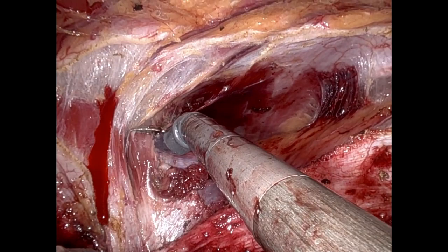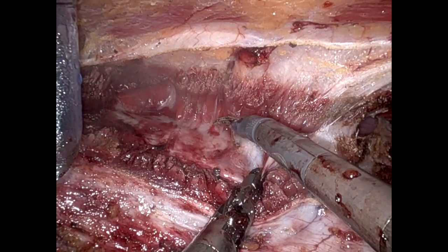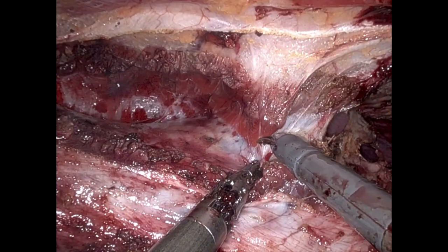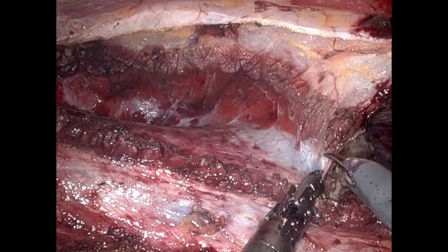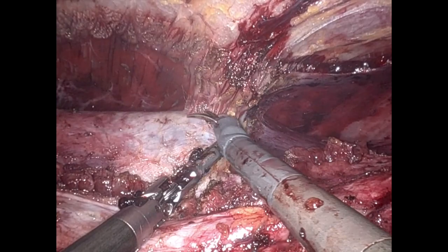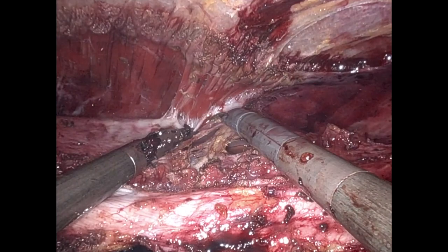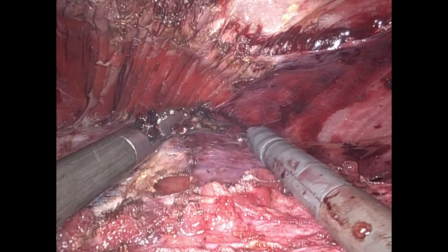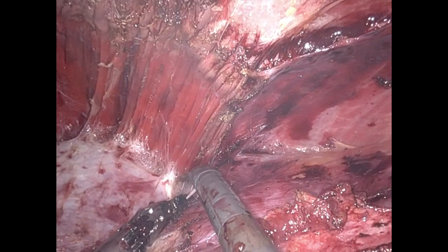This process of transversus abdominis release can be performed bottoms-up or top-down — I will usually just go where it's easy. In this particular case, a bottoms-up TAR made more sense, and that's the technique I utilized. There were a few holes made in that posterior sheath, largely related to the lysis of adhesions requiring fair amounts of sharp and thermal dissection around the peritoneum, making it weak. This is something to be mindful of: preserve that posterior sheath as much as possible. In this case, it was not an issue to close the posterior sheath defect.